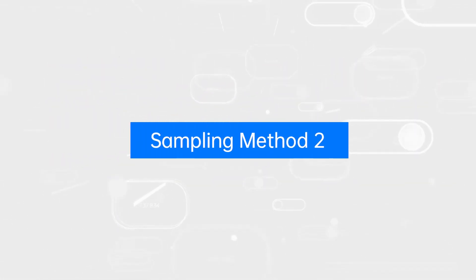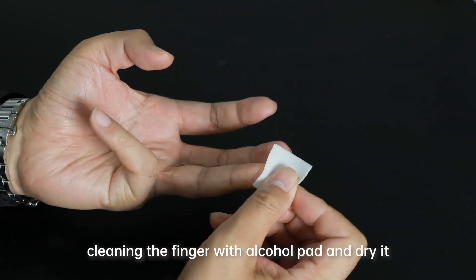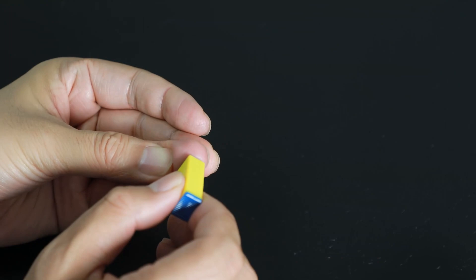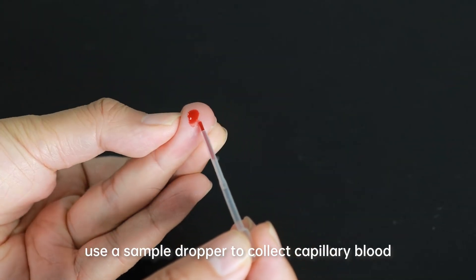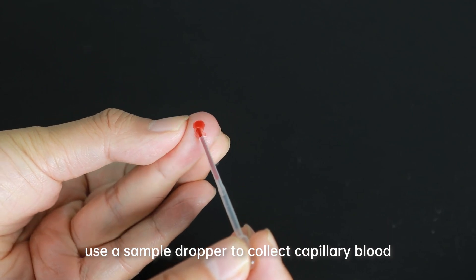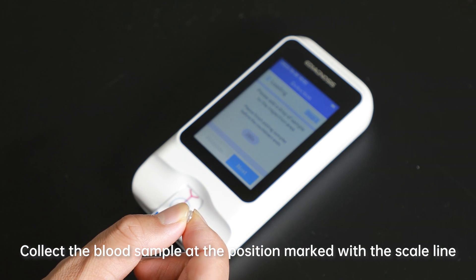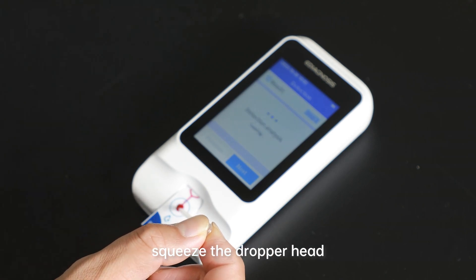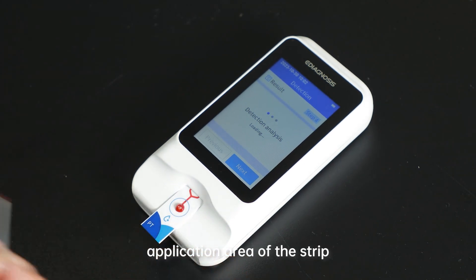Sampling Method 2: Massage the lanced finger gently, clean the finger with an alcohol pad and dry it, then puncture the fingertip. Do not press or squeeze the finger. Use a sample dropper to collect capillary blood at the edge of the fingertip. Collect the blood sample at the position marked with the scale line, then squeeze the dropper head and drop the blood sample into the sample application area of the strip.